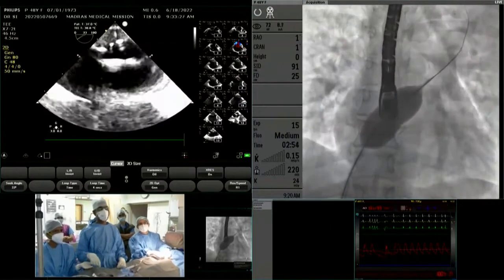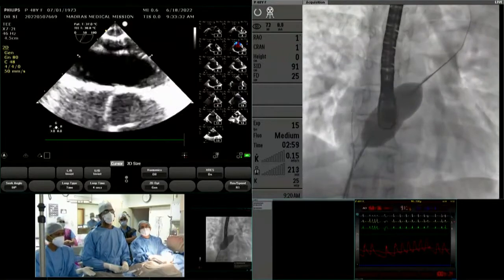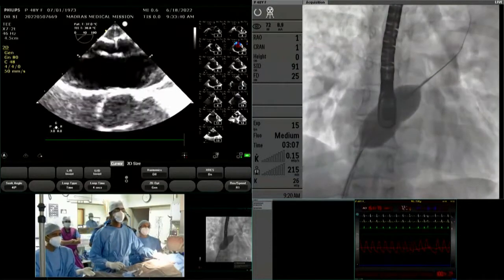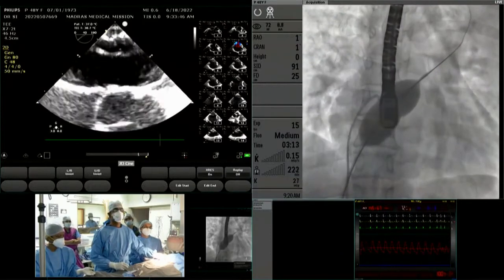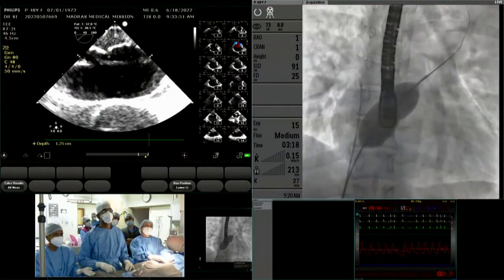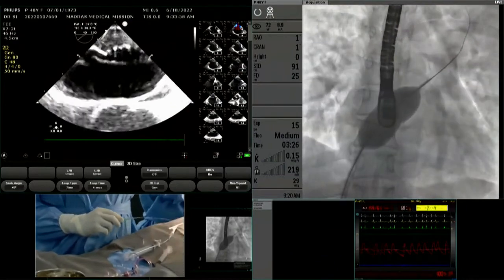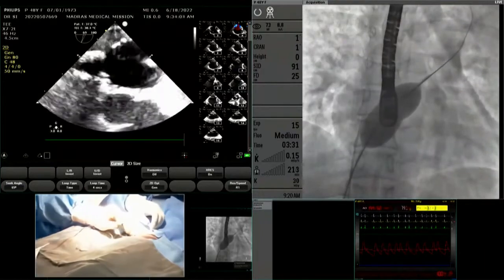Our experience, what I want to tell you, is there are multiple methods. The IVC defect with a multi-purpose catheter, if you go from the IVC, the posterior inferior defect can be straight away crossed, because you all know that in fetal circulation, IVC flow goes to the LA. So that's why the multi-purpose catheter straight away goes there. Probably the Judkins right coronary catheter doesn't allow you to go. Second is the inflated balloon. It is not only across the defect, it is in the RA also. It sometimes prevents your catheter from going through the desired defect.